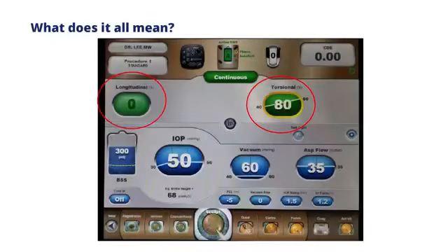Now, what are all these other things? So the top right corner is your torsional or ultrasound energy, and on the top left that's the longitudinal. So these are settings, or what we've been familiar with before torsional came about, is really how ultrasound energy is delivered in your phaco handpiece. So ultrasound energy is obviously important, and that's what's emulsifying the nucleus, and we've been very familiar with very efficient use of torsional energy now, but longitudinal in many cases are still useful, and whether that's in the individual surgeon's hands, they like to use an interplay between a longitudinal or torsional is entirely individual preferences.